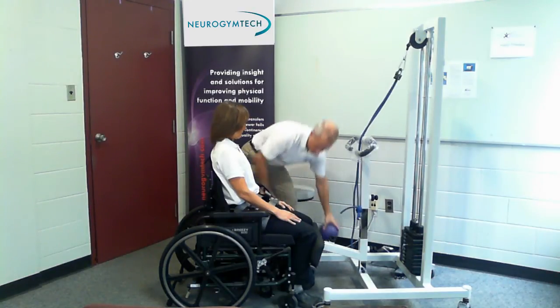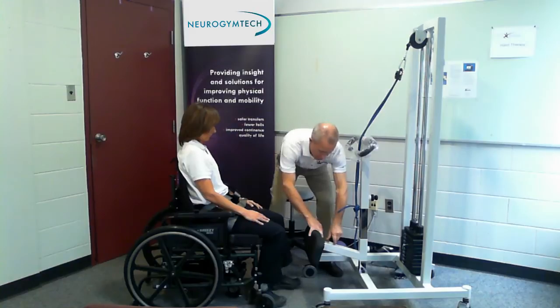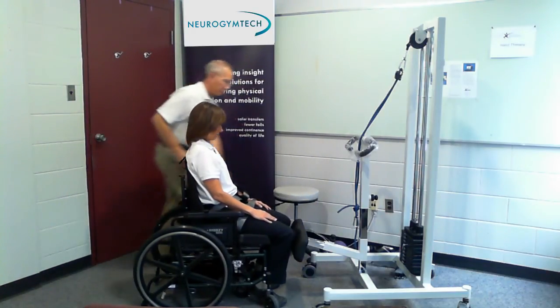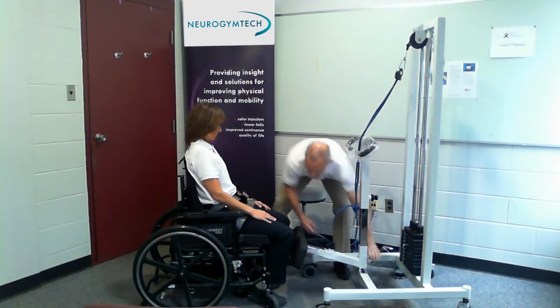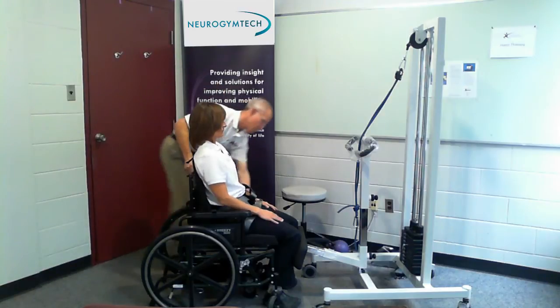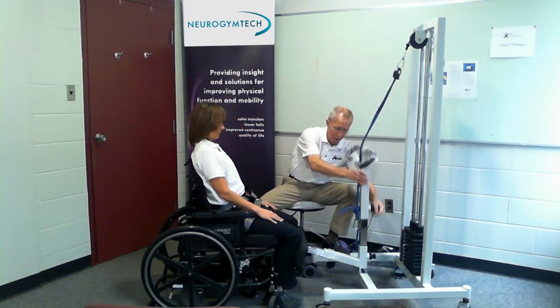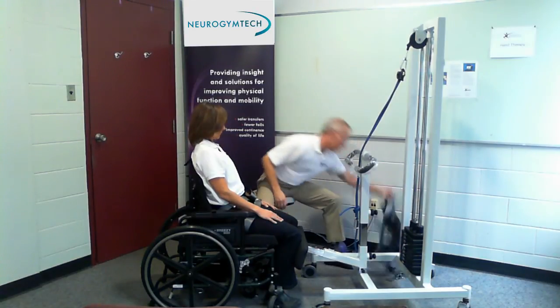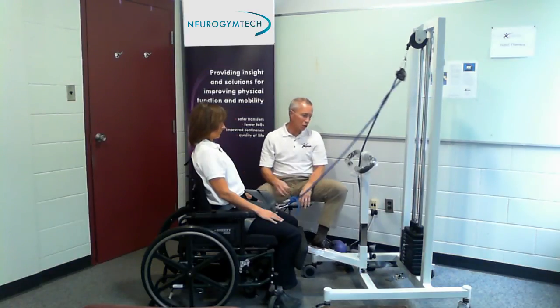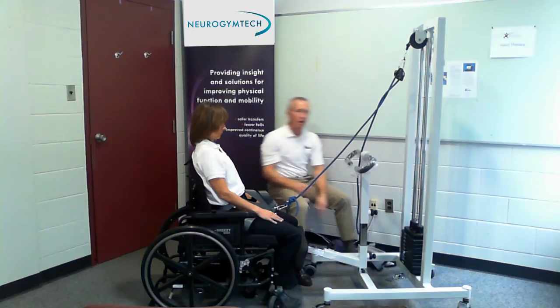For application one, I'm going to bring the wheelchair back a bit and bring the knee pad out so that there's three holes showing — I'm also going to lower the pad height, because remember I want it just slightly below the patella, and the further out it is, the higher it is. This patient is a very large cognitively impaired patient. We have the knee pad back, and we may have the bariatric sling if she's quite large. We're going to engage a little more weight than normal — 50 pounds in this case — and you'll see why in a minute.